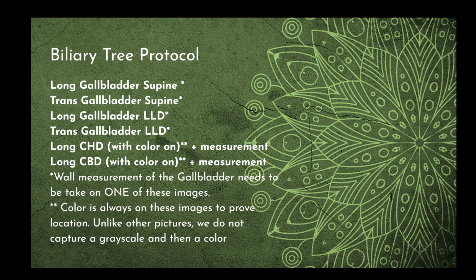As far as the biliary tree protocol goes, again, you will be taking representative pictures of the gallbladder. For our purposes on campus, you just need one in long and one in trans while the patient is supine. And then you're going to roll the patient into the LLD position, and again, you'll take a long and trans picture of the gallbladder.